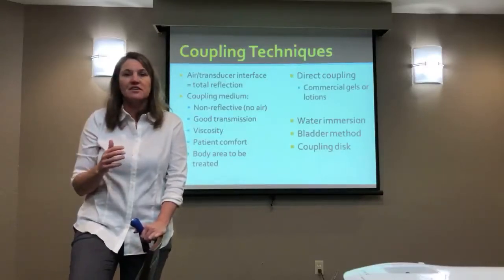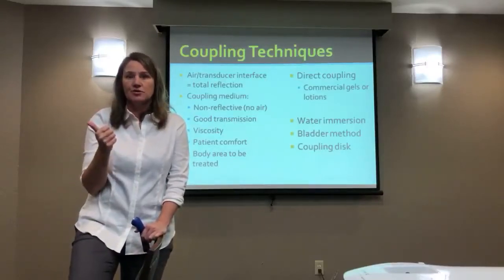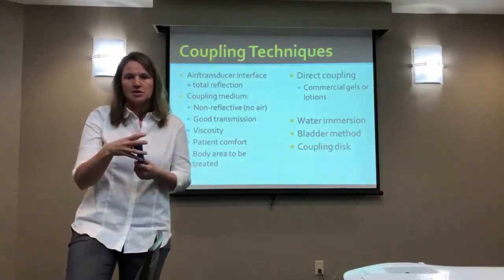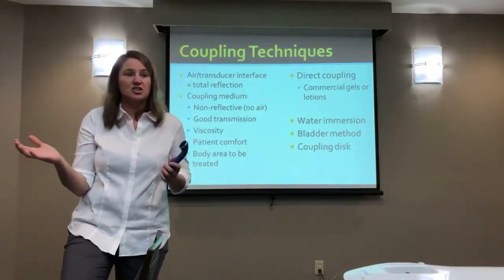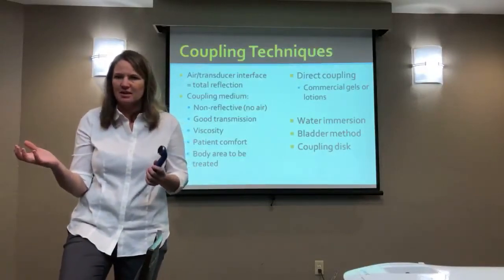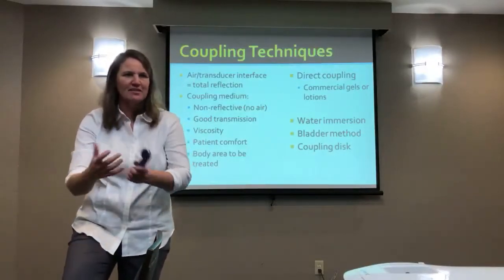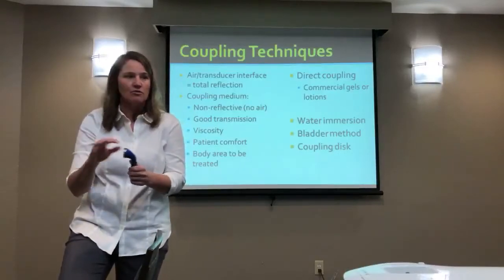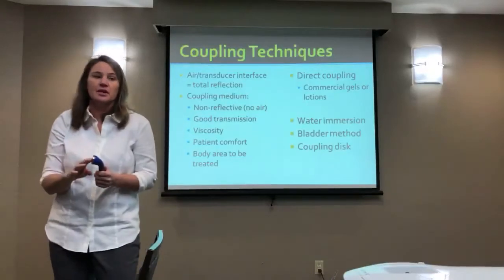Over the years, I've seen various products come out. I've seen ultrasound condom covers. Basically, they rolled on, and they were meant to offer infection control. And I remember thinking to myself, am I touching this and removing it, and everything is negating any benefit I would have gotten from this thing being over it anyway. I never understood the concept.